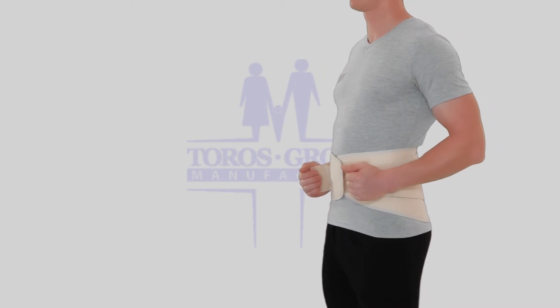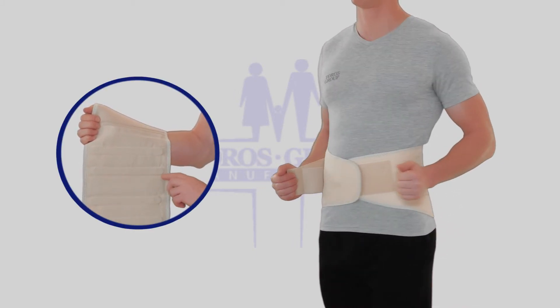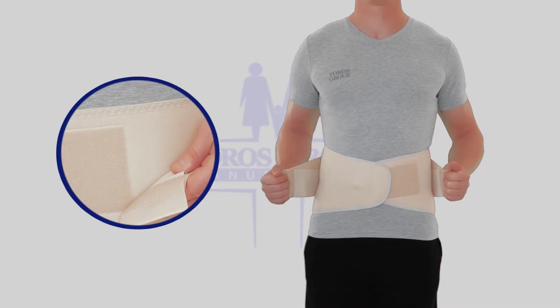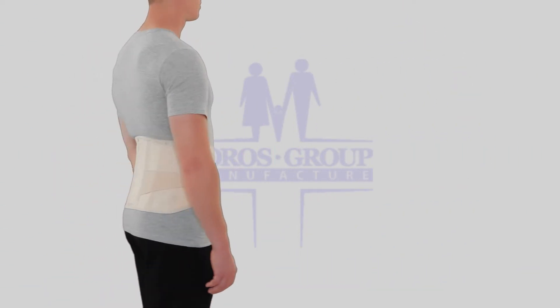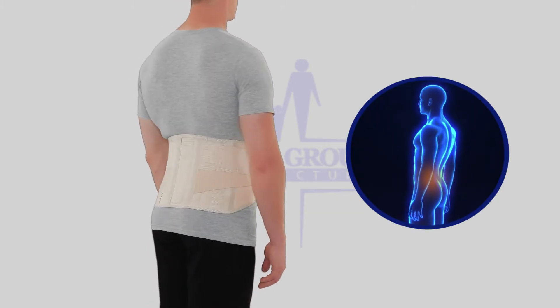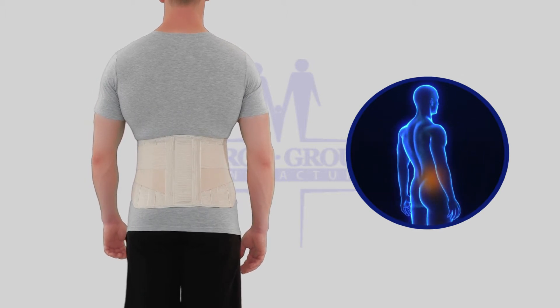Vertical supports stabilize the back and prevent rolling. The brace is ideal for rigid fixation of the lumbosacral spine during the rehabilitation period after injuries and spinal or abdominal surgery, and prolapse of the kidney.